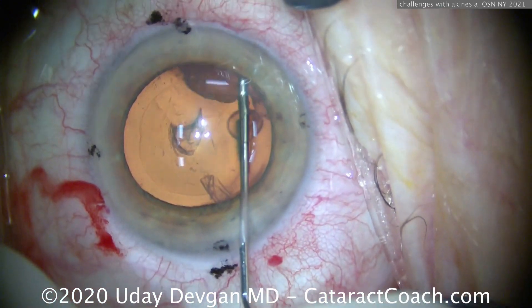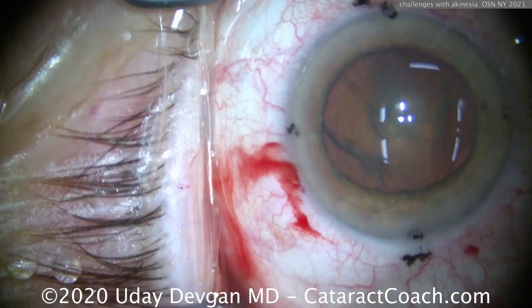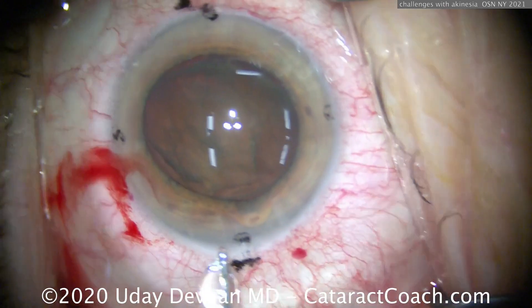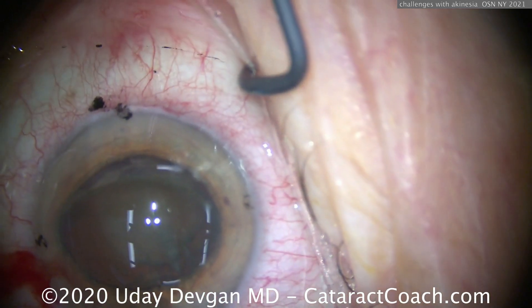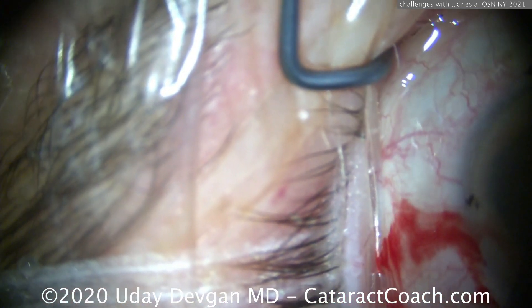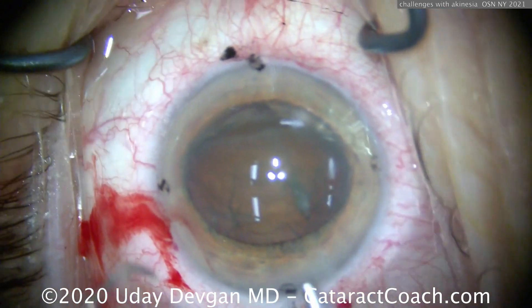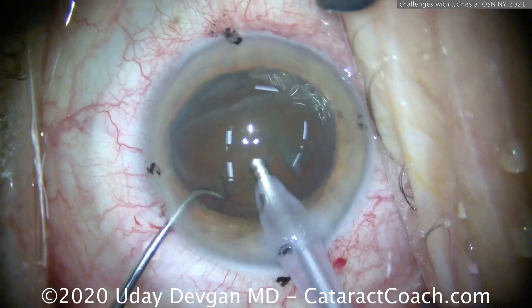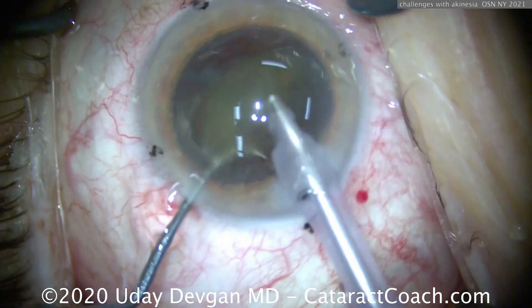Now it's going to be tough during phaco too. Normally with two instruments in the eye, you fixate the eye and it can't move much — but we're not talking about eye movements, it's the patient's whole head and body. This is with the maximum sedation we can give, the head taped down, and my surgical scrub tech holding the patient's head. There's a little iris prolapse — let's push that back in. I've tilted the nucleus partially out of the capsule bag. A little more viscoelastic to protect that cornea. We have to be very careful about the posterior capsule — break it and we can't put the toric lens in. This patient is relatively monocular; the other eye had a vascular occlusive event in the retina.